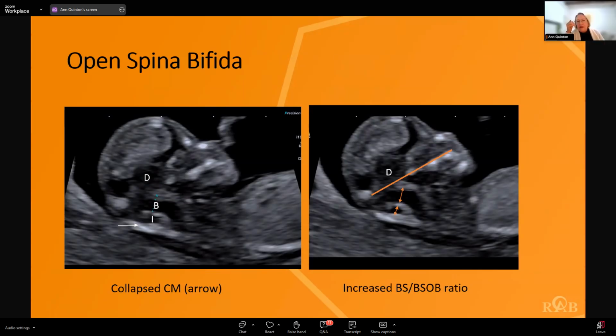Well, you can't make a diagnosis of trisomy on ultrasound. You can look for ultrasound features of trisomy. Spina bifida has been reported in occasional cases of trisomy 18, and for trisomy 13, holoprosencephaly. Apart from that, the fetal brain with trisomy 21 can look normal.